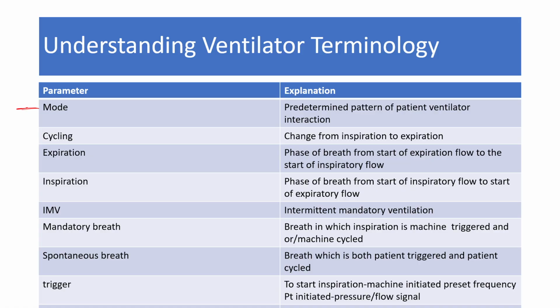So if you go back here and see our one compartment model, if there is no flow here, you have a flow of 0 into resistance. What pressure is monitored at the end of inspiration here is the alveolar pressure, that is the plateau of alveolar pressure. So that you see in the volume control mode of ventilation. If it is a pressure control mode of ventilation, depending upon the compliance of the lung, the volume will vary and you have to keep a watch on the volume.